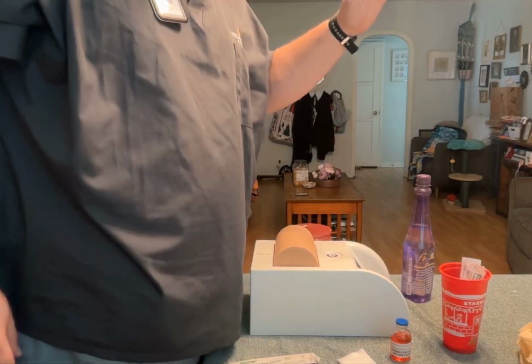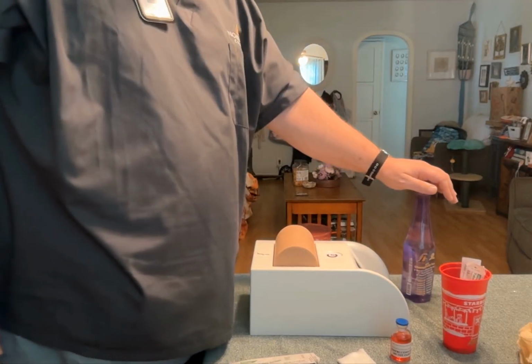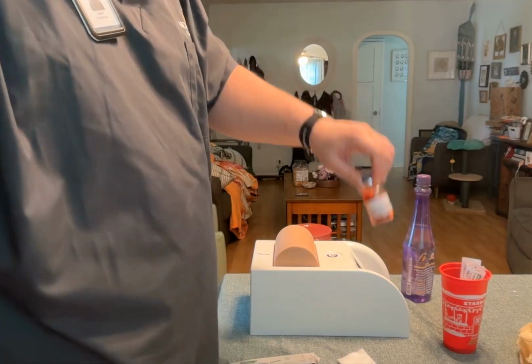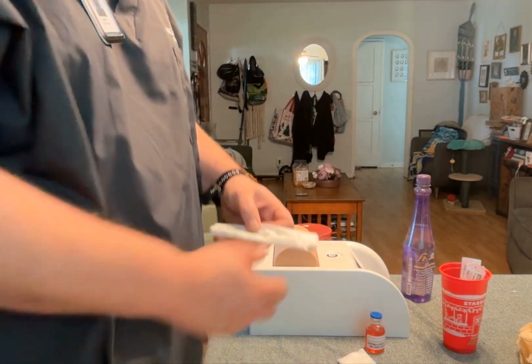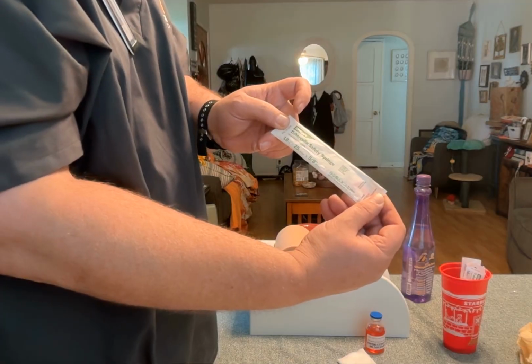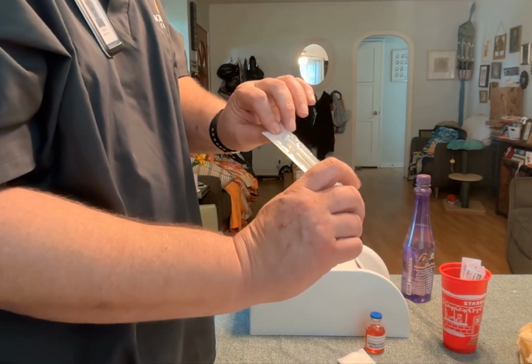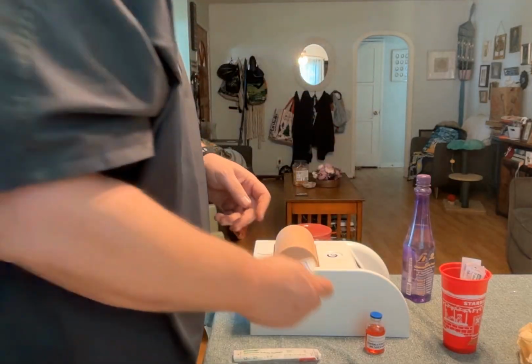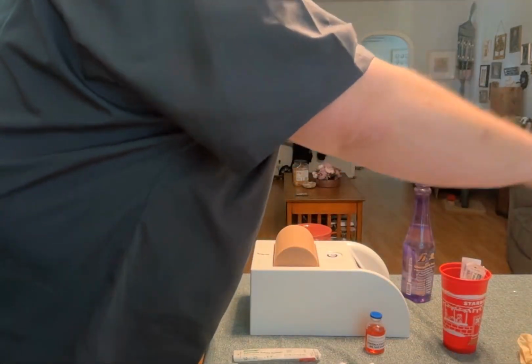I've got hand sanitizer, I've got a sharps container, I have medication, I have my tuberculin 1 milliliter 25 gauge 5/8 inch syringe with the red cap. I've got alcohol prep pads, I have gauze, and I have gloves.